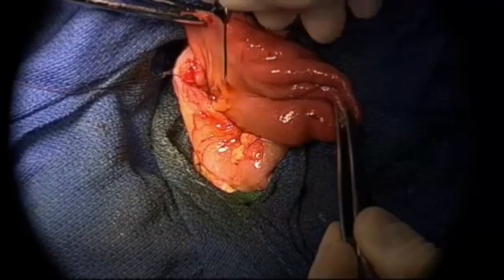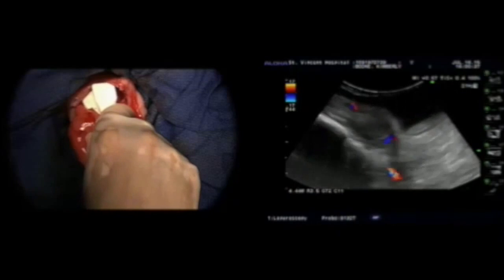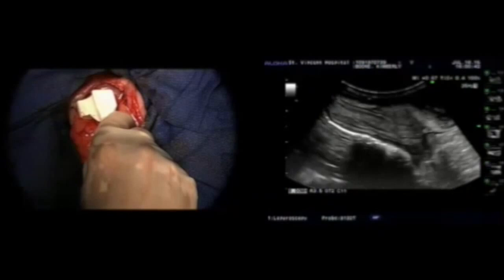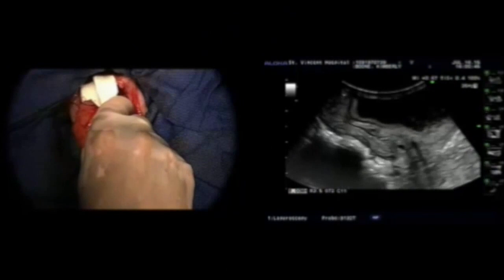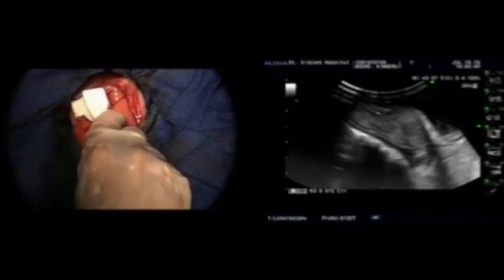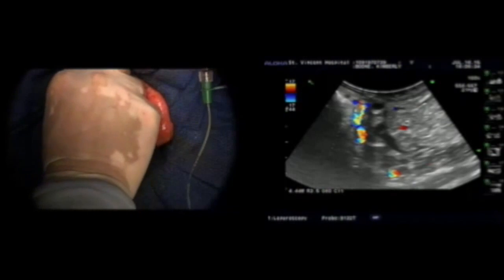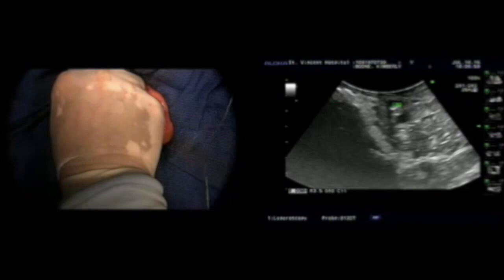A lacrimal probe was then introduced through an orifice in the cyst that appeared to be the previous puncture site. The probe was going into the cyst, but we could not cannulate any of the pancreatic duct or biliary duct from here. Intraoperative ultrasound of the cyst revealed the probe inside the cyst cavity, but not in the CBD or in the pancreatic duct.